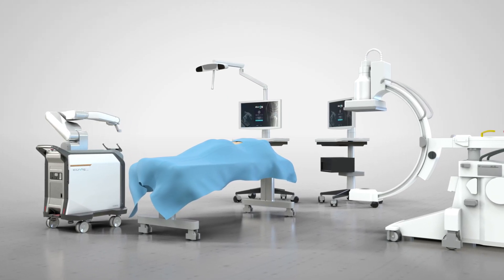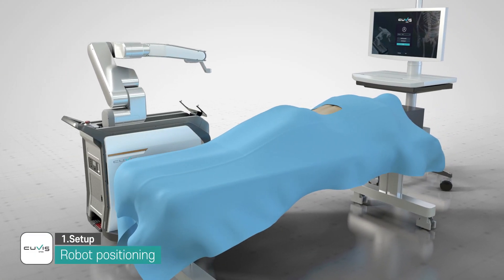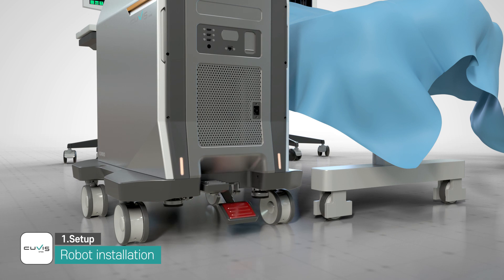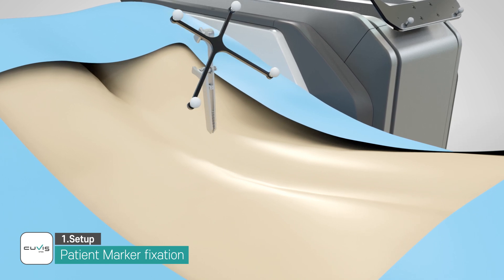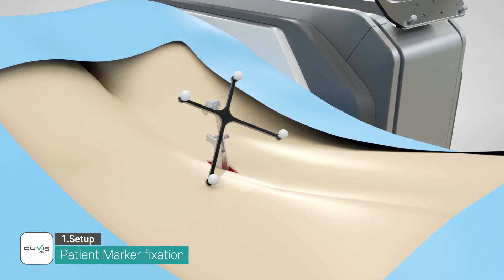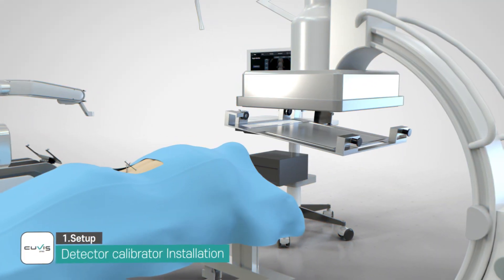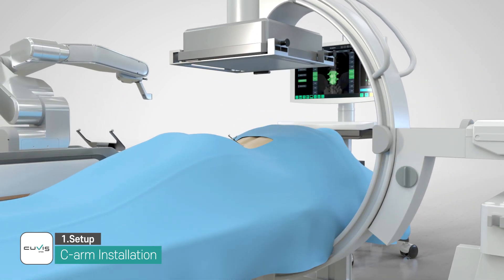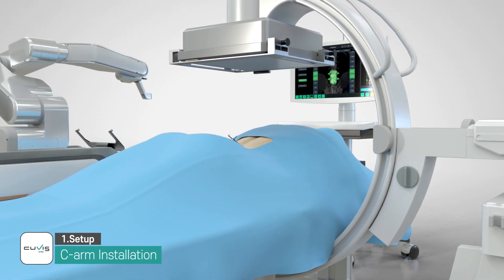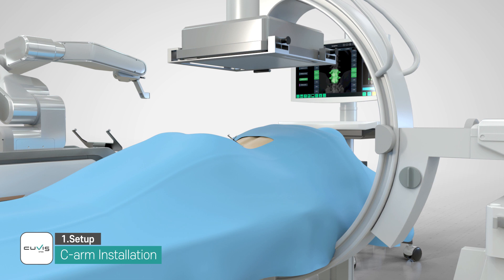The user selects the position of the robotic arm and prepares the imaging device and the accessories. The patient marker is fixed to the spine for tracking the patient's position in real time. Target vertebras are selected. When using C-Arm as an intraoperative imaging device, the source calibrator and the detector calibrator must be prepared in advance. The detector calibrator is mounted on C-Arm before proceeding to the scan step.